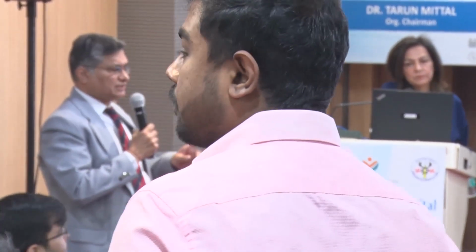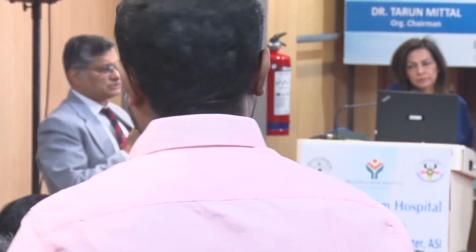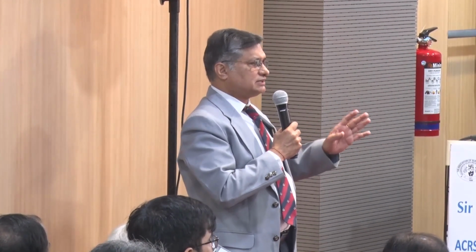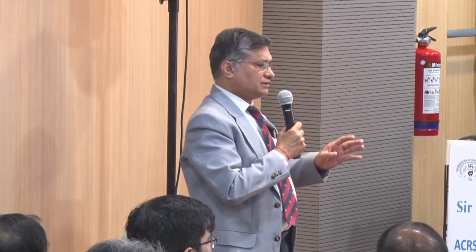My second comment is about Goodsall's rule. Goodsall's rule is true only for 65% of the cases. So always we cannot go by the Goodsall's rule. So in patients where there is a deep-seated fistula, MRI is essential. Third thing, when you are doing MRI, MRI is like a GPS. Okay.